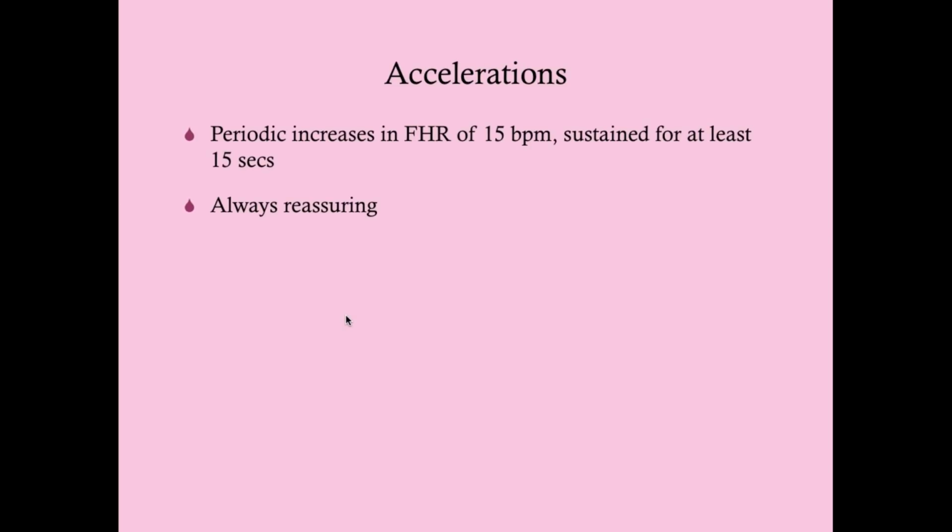Okay, what are accelerations? You heard me talking about these a little bit already. Accelerations are periodic increases in the fetal heart rate of 15 beats per minute sustained for at least 15 seconds, but no more than 2 minutes. If it's more than 2 minutes, then we consider that a change of baseline. So you'll hear this 15 by 15 all the time. That's an acceleration. So an increase in the fetal heart rate of 15 beats per minute for at least 15 seconds, and then returning back to what our baseline was.